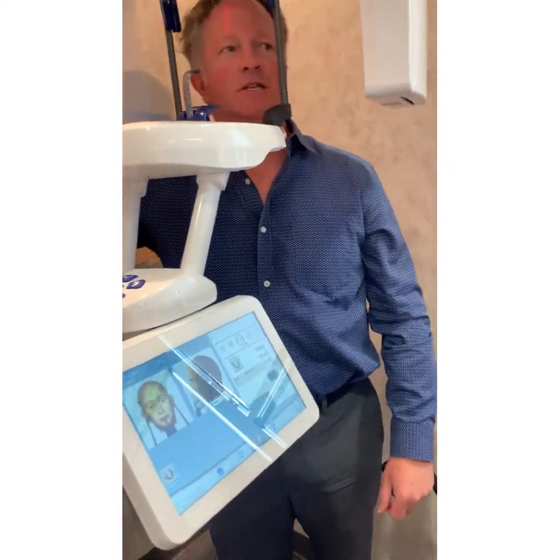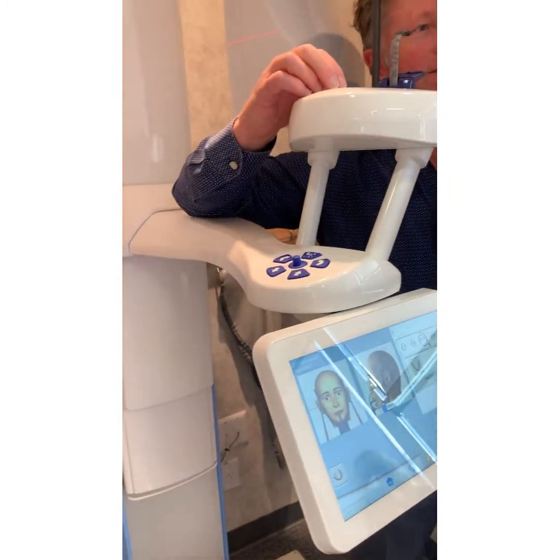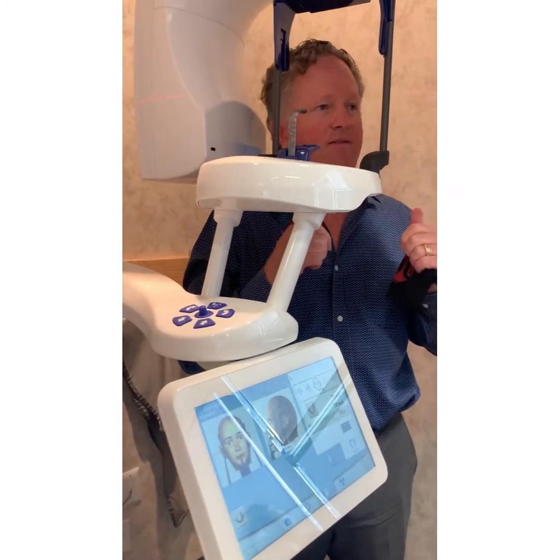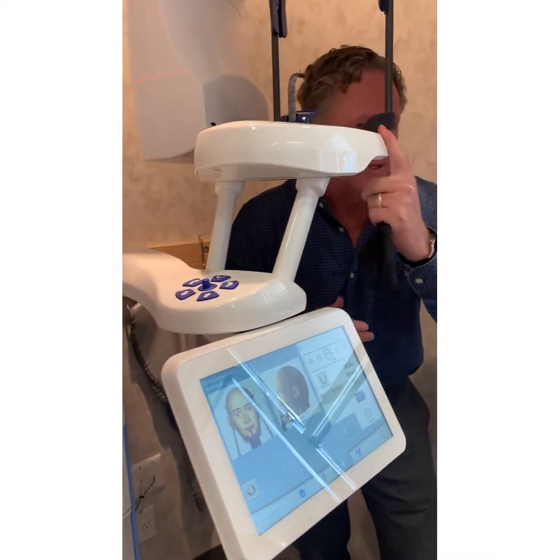These two lights are just guides. This light right here actually determines in what proximity the sensor is going to pass in front of your oral cavity. So if this line is not between 10 and 11, if it's too far forward, you're going to get little mousy anteriors in front and a whole lot of spine. If it's too far back, you're going to get big buck teeth in front and no spine. It's critical that this is between 10 and 11.